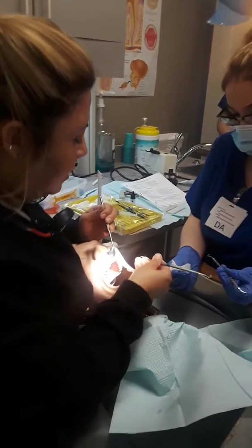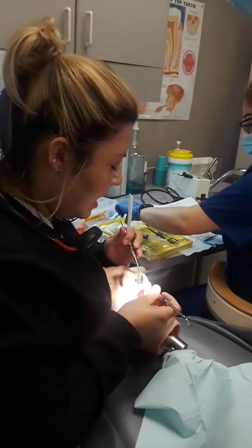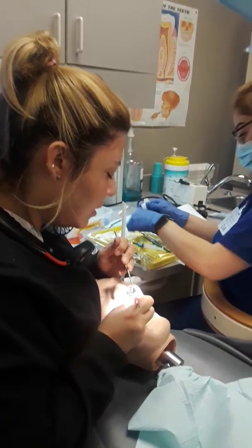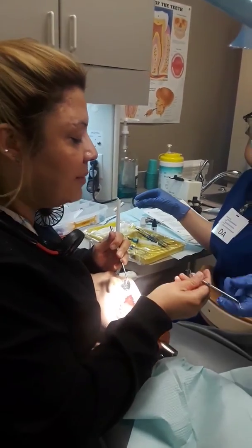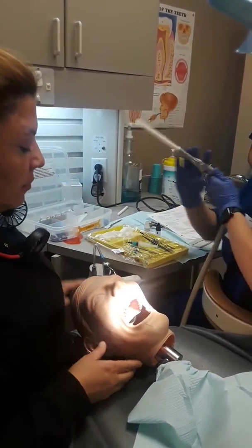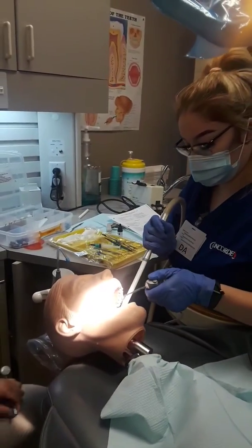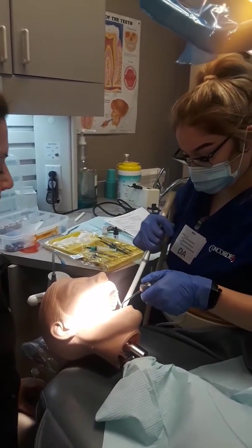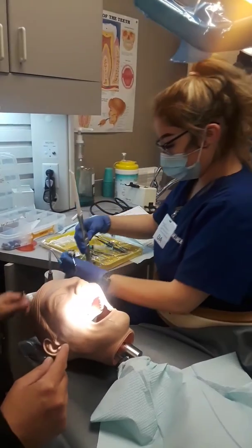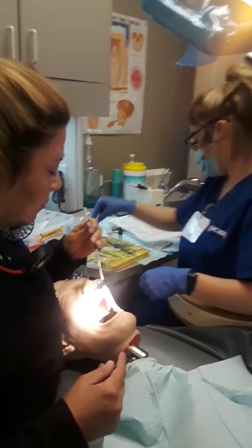Pass refining instrument — some doctors may not use this. This one is a GMT and this setup has hand cutting instruments. If your next step doesn't say rinse, rinse it off anyway, then pass etch.